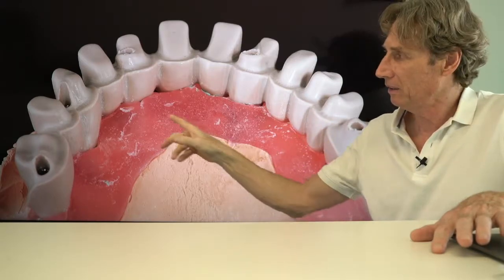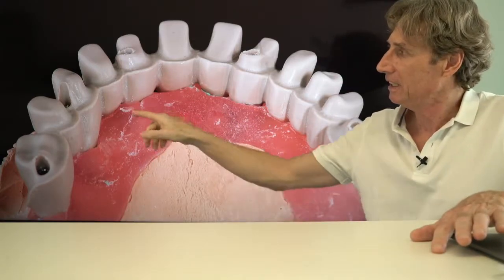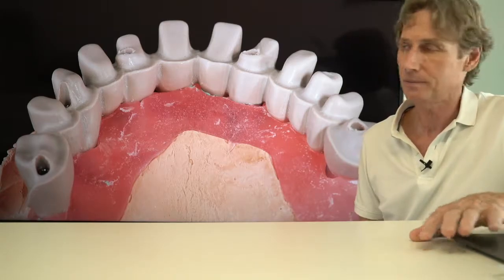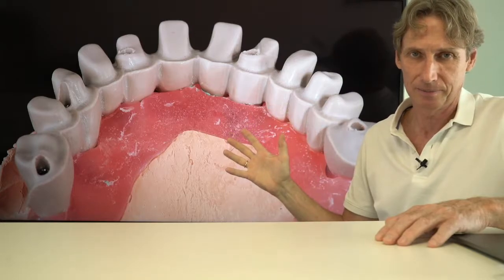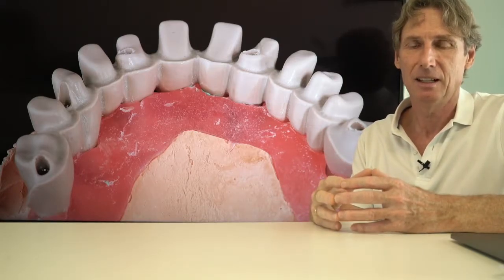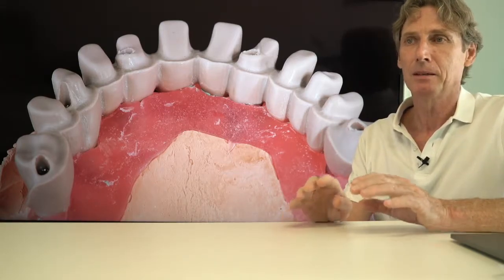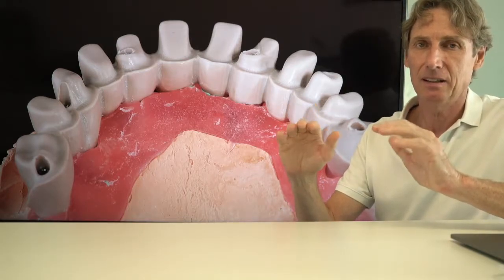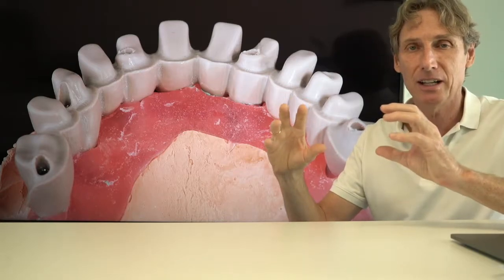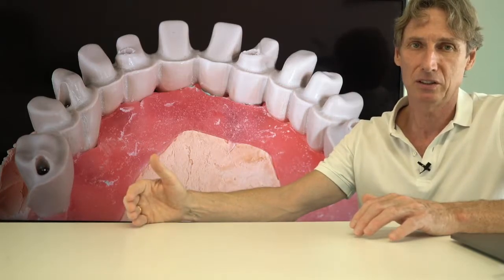We had this good experience to make it fully anatomically in the basal side and then the oral side, and here now we are prepared to easily cement our single crowns. This structure is extremely lightweight. This structure is elastic, so PEEK has a bone-like elasticity. That's very important because therefore we always achieve a passive fit, because due to the elasticity, the bridge and also the veneered bridge is able to compensate minor errors that not always can be avoided, especially if we go from the model to the patient's mouth.